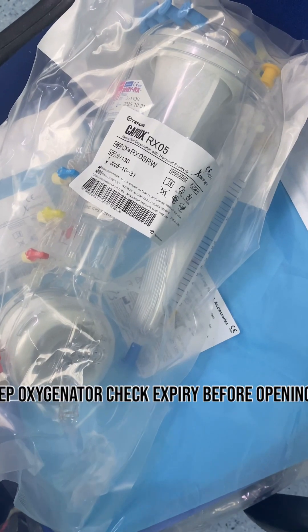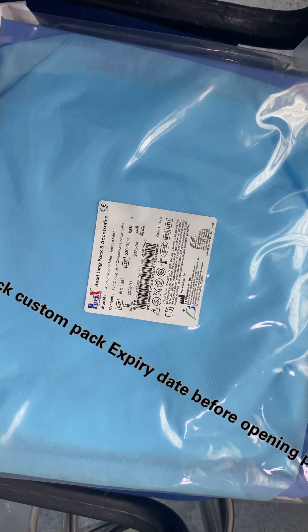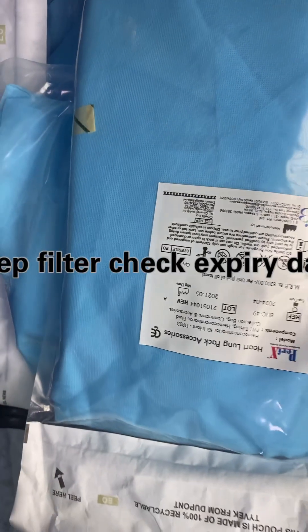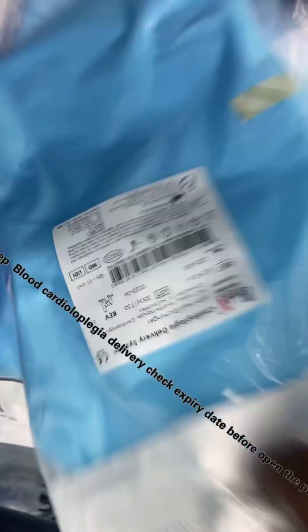Click the oxygenator and check expiry before opening. Check custom pack expiry date before opening pack. Keep filter and check expiry date. Keep blood cardioplegia delivery and check expiry date.